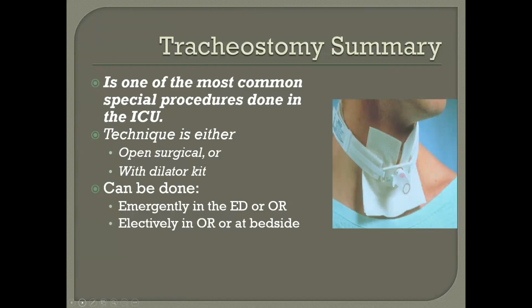There's also some data out there to suggest that the longer you go out, particularly beyond 21 days with an endotracheal tube going through the vocal cords, there's more likelihood of vocal cord paralysis or some sort of damage. So trach-ing patients is good because some of them wean faster, because it's a shorter tube. You can do mouth care, they can eat, better quality of life. It's not great, but better quality of life, but it's also the issues that I just mentioned.